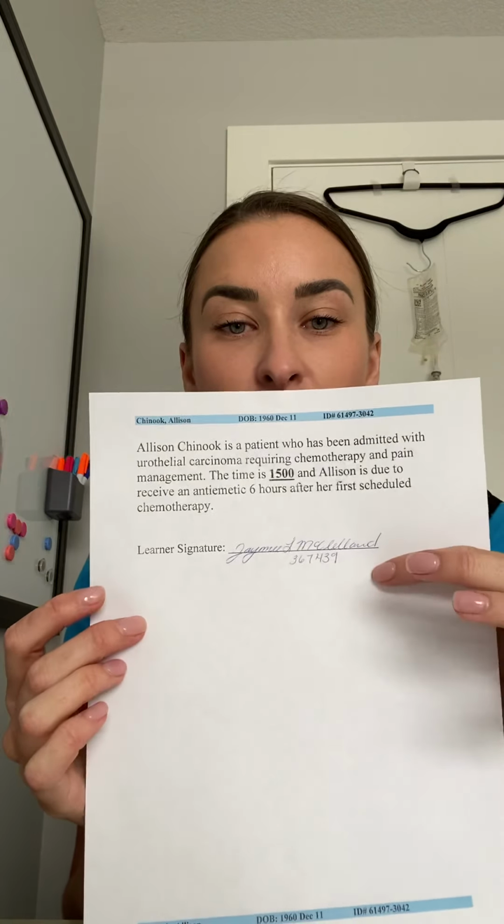This is the scenario. Allison Chinook is a patient who is being admitted with urothelial carcinoma requiring chemotherapy and pain management. The time is 1500 and Allison is due to receive an antiemetic 6 hours after her first scheduled chemotherapy. I've signed it here with my student ID there. We can put that off to the side now.